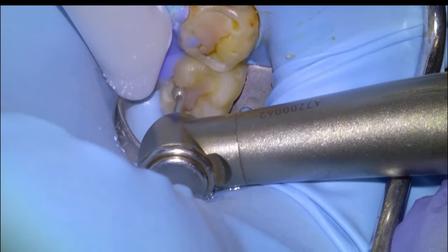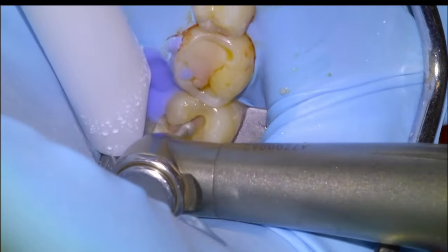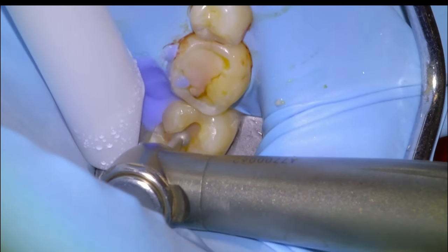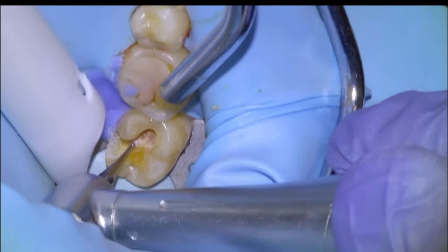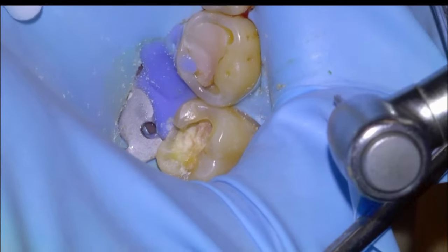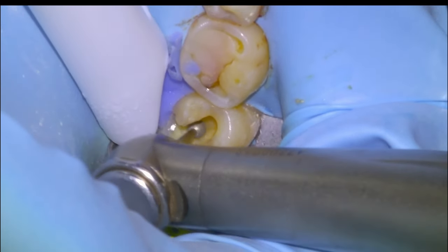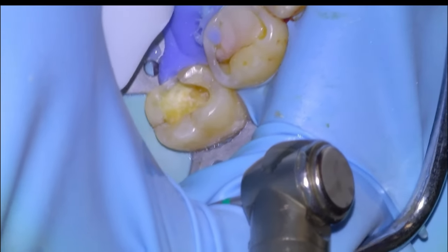We'll begin preparing by removing all the old composite material. We'll use a high speed to get the bulk of it, and then I'll typically dry off the tooth and use a slow speed to remove any of the remaining restorative material until we have all of it removed. After that, we'll make sure all of the internal surfaces are nice and rounded with a large round diamond.